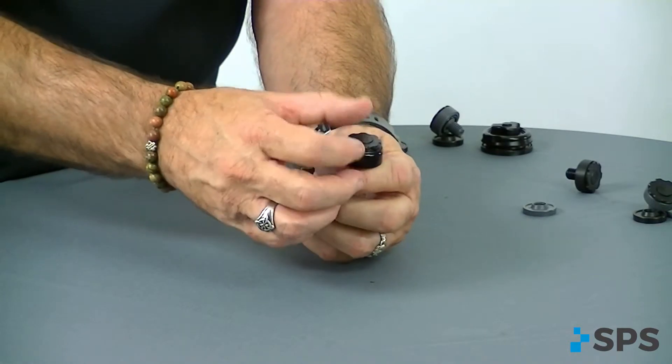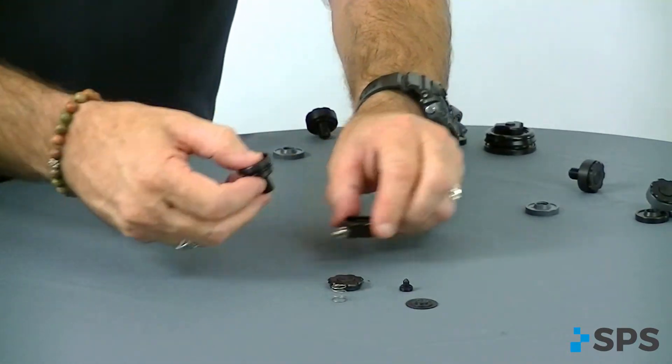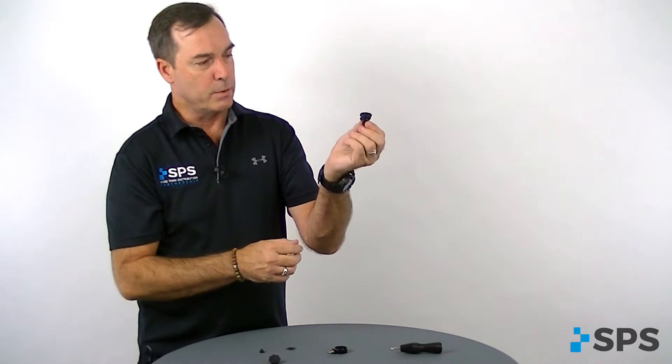Again, it screws apart so you can clean it. The housing does slide off so you can clean all the air entry and exit points.